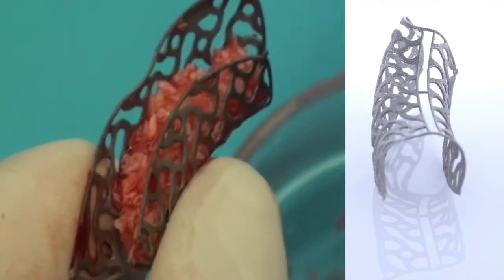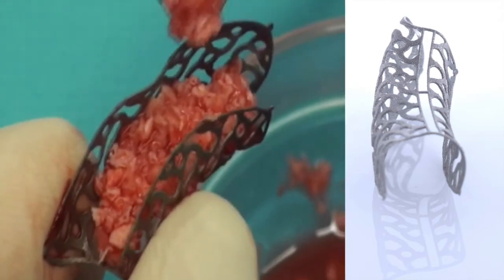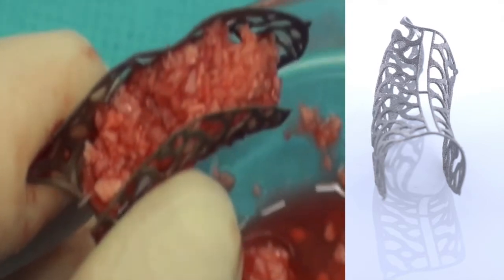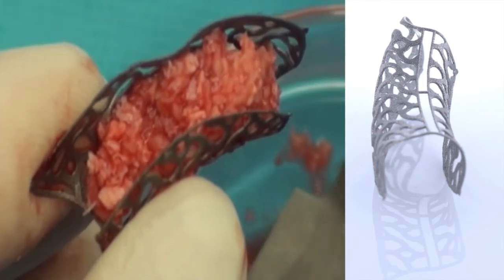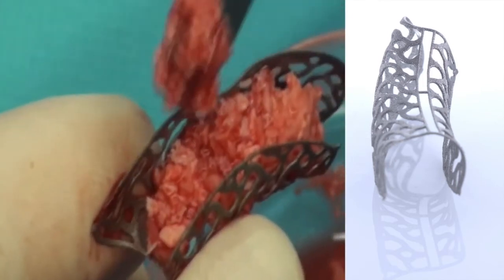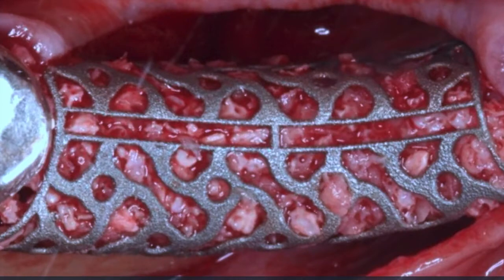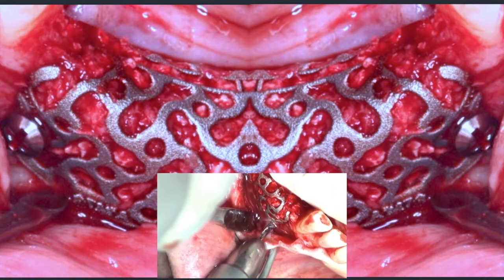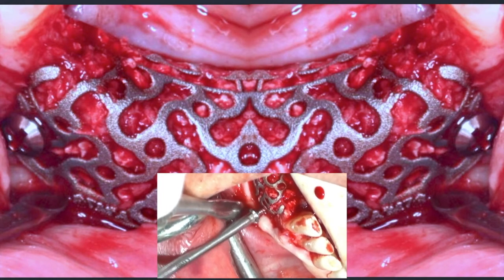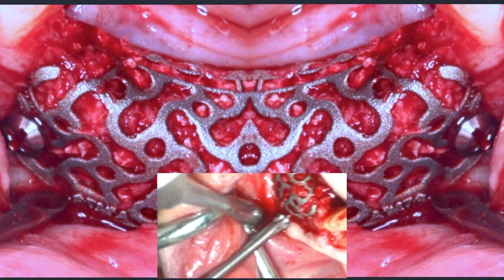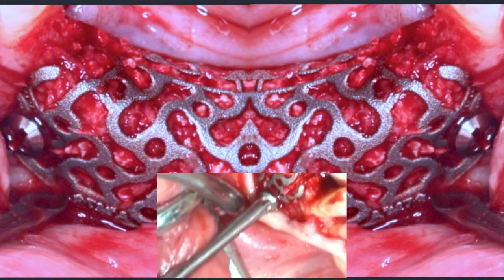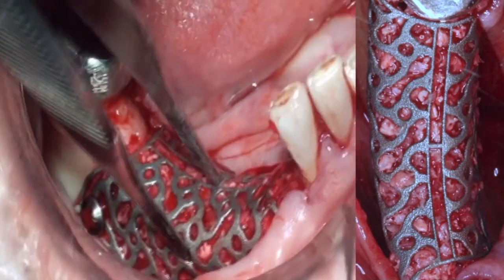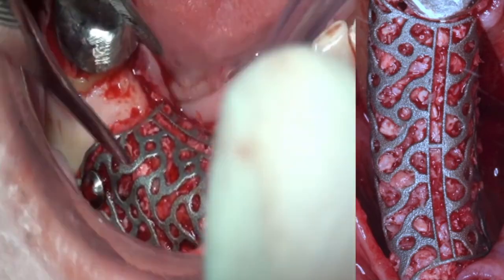At this point, approximately 80% of the surgery is done and about 30 minutes have elapsed. We take our autologous bone mixed with biomaterial and compact it carefully inside the membrane. With the membrane in its correct position, we fix it with osteosynthesis screws on the vestibular side only, placing one mesial screw and one distal screw — this provides sufficient immobility without lingual fixation.